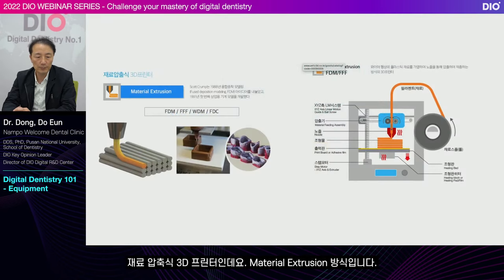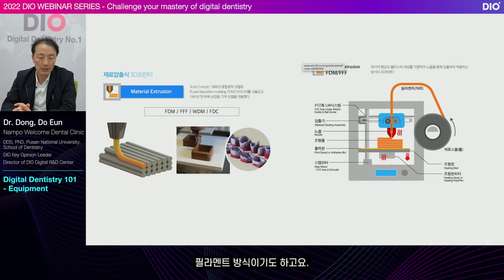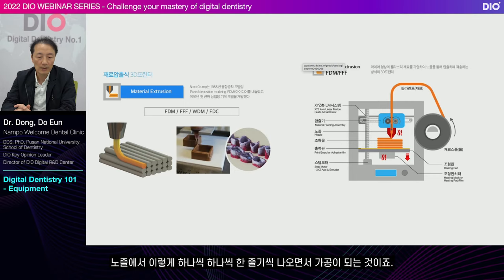This is a material extrusion 3D printer. This uses the material extrusion method. It's also the filament method. It comes out from the nozzle like this, one by one.